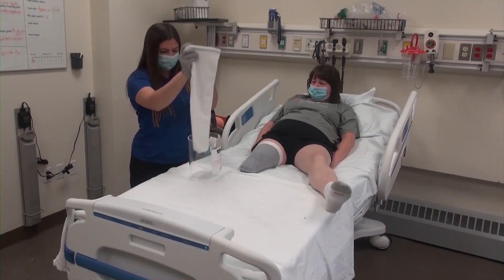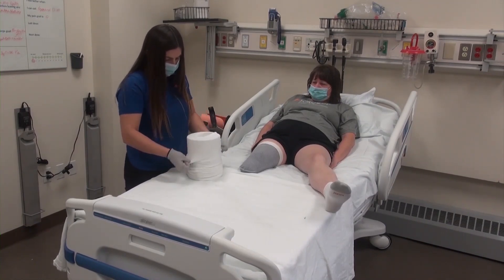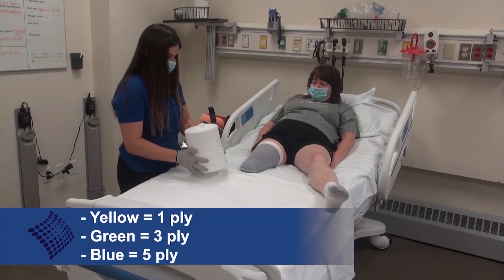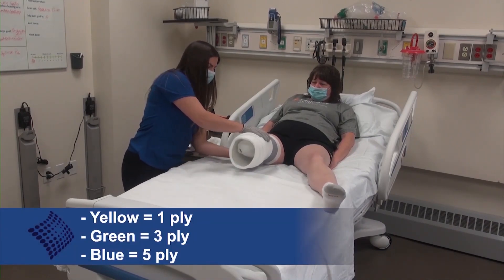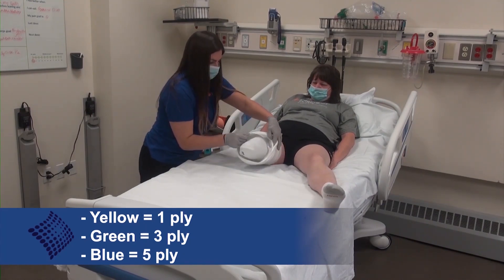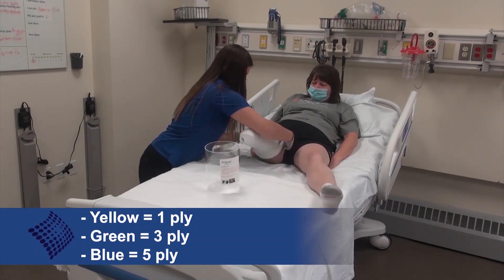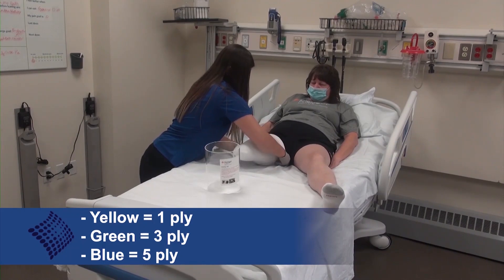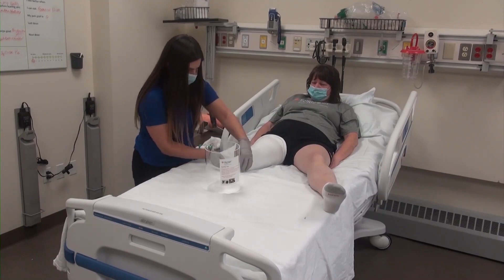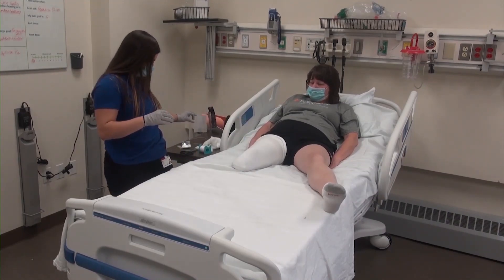Prosthetic socks come in three different thicknesses for the purpose of filling up space within the rigid removable dressing once the patient's residual limb begins to shrink and the amount of fluid reduces. These ply thicknesses include one ply, or yellow stitching, which is the thinnest and normally what will be applied initially as the limb is usually largest right after surgery; three ply, or green stitching; and five ply, or blue stitching. The higher ply amounts can be used later to fill up space between the shrinker and the rigid removable dressing as the patient shrinks.